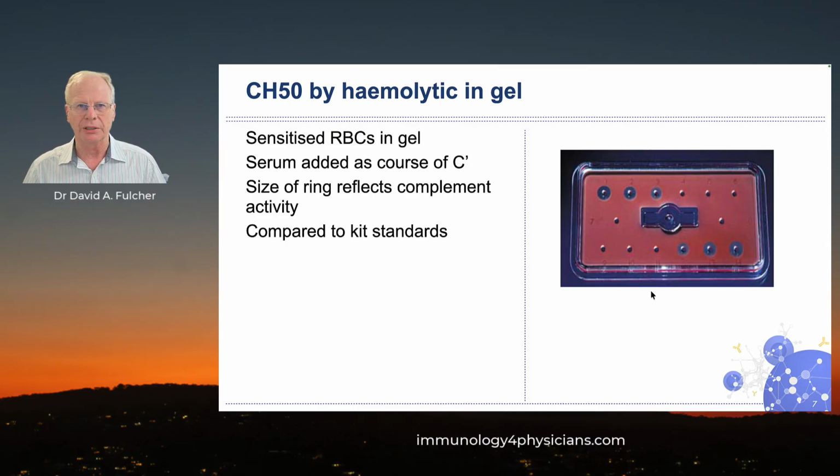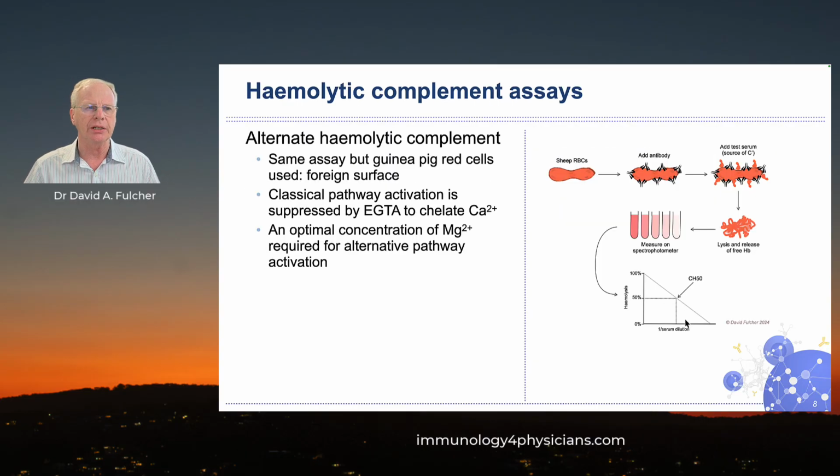If you heat complement, it loses its activity very quickly in a test tube after it's been bled. So just remember, before you go announcing that you found a patient with complement deficiency, make sure that they have had the collection done really carefully. All right, are there better ways of CH50?